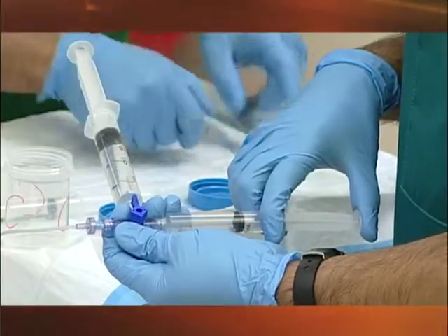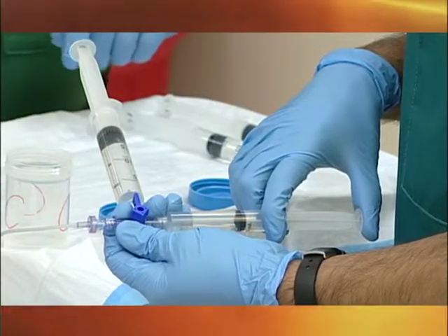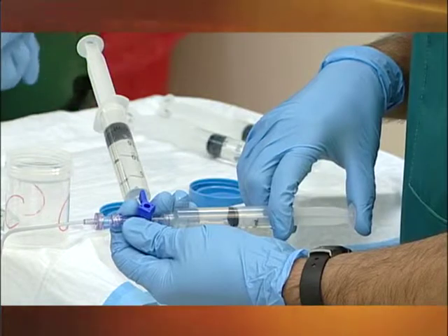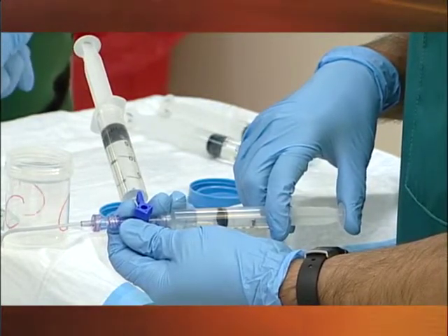For those patients who are already receiving dialysis through a catheter, the contrast injection is not a concern. However, those patients who are not yet on dialysis may have some concerns about receiving contrast dye. You may have been told by your kidney doctor to avoid contrast. However, in this particular case, it should not be a major concern. The amount of contrast which is used in our procedure is a small and insignificant amount, usually between 15 to 20 milliliters. In fact, doctors have actually measured patients' kidney function after the venogram and found that their kidney function did not worsen.